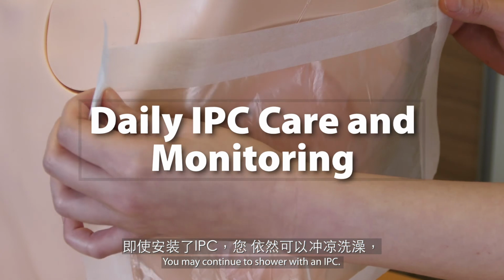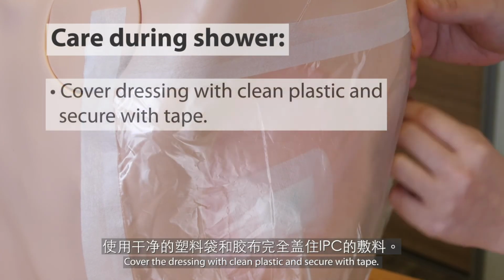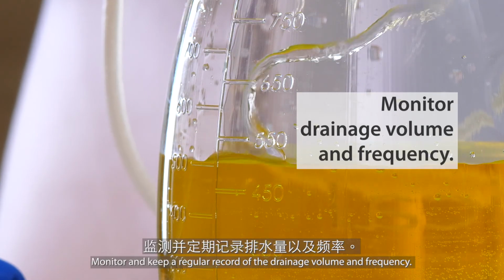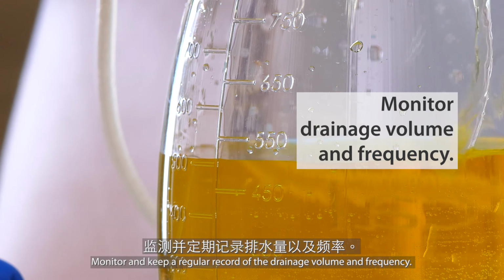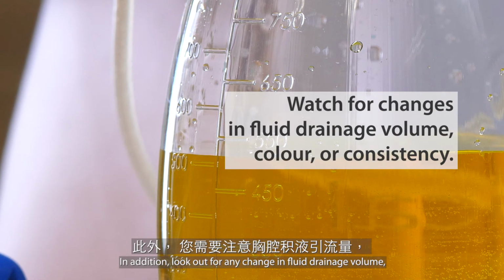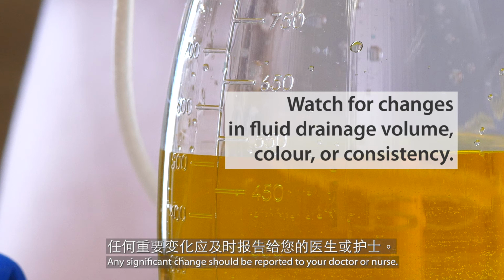You may continue to shower with an IPC. When showering, cover the dressing with clean plastic and secure with tape. Monitor and keep a regular record of the drainage volume and frequency. In addition, look out for any change in fluid drainage volume, color, or consistency. Any significant change should be reported to your doctor or nurse.